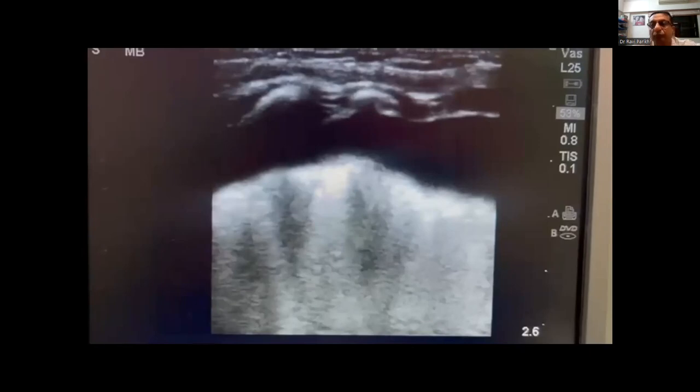Now, normally that will be in the fifth and sixth space, and you want to locate the liver, and the liver can actually be quite low if you have a very large effusion. So when you're doing a comprehensive scan for effusions, the scans that are longitudinal are diagnostic scans. And you might find that the pleural effusion, even if it's large, is quite small based on the distance between visceral and parietal pleura anteriorly, but increases as you go to the mid-axillary line, posterior axillary line. But as you go down, when you do your transverse scans in each plane, you're able to identify the maximum pocket. And that is basically how you decide where you're going to put your pigtail or chest drain.